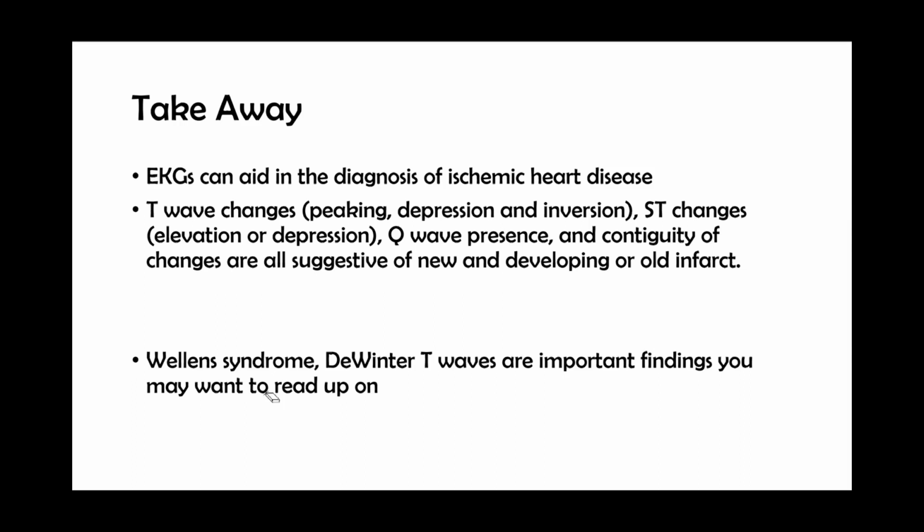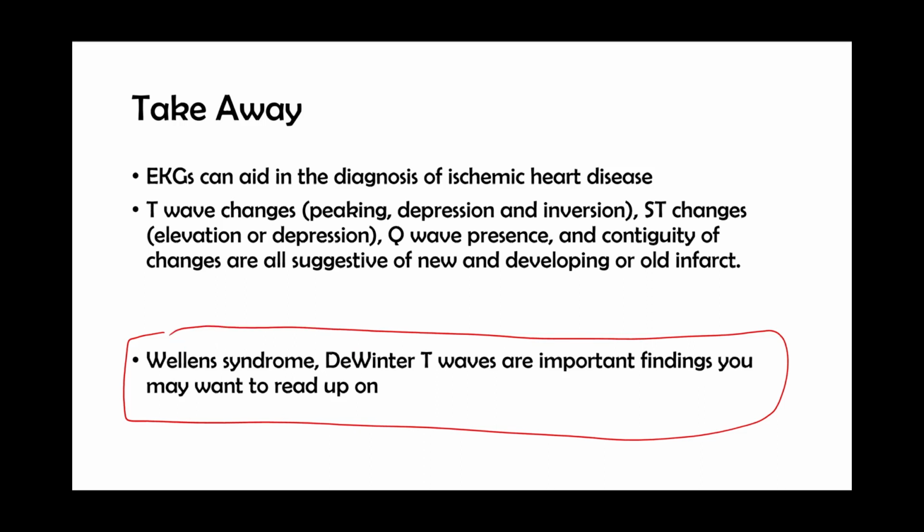I do want to note that there are other EKG changes that are concerning for ischemia and infarction that might be worth knowing. These include the Wellens syndrome and De Winter T waves. Once you establish a basic understanding of EKGs, it might be worth reading up on these.